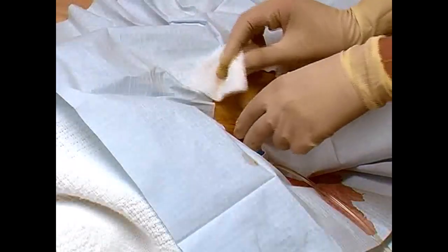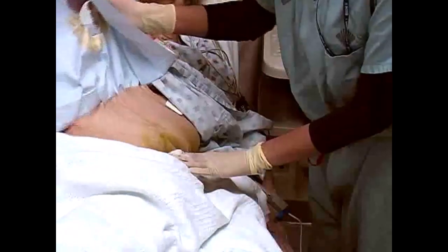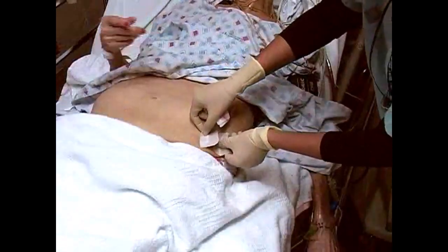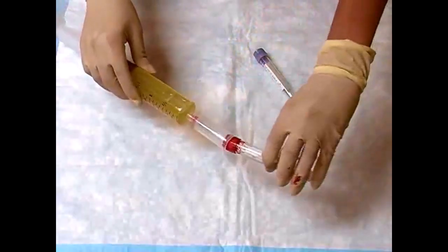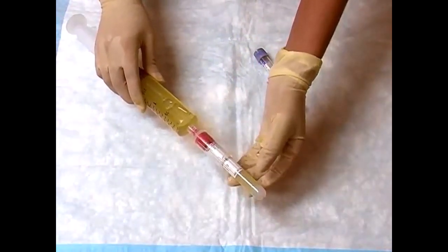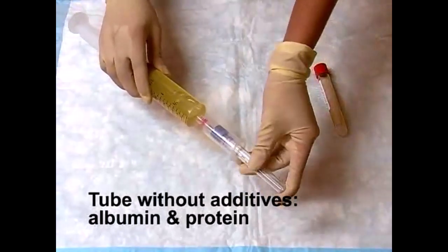Once fluid collection is complete, withdraw the catheter from the abdomen, remove the sterile drape, and wash away the cleansing agent from the skin. Finally, place a sterile occlusive dressing over the puncture site. Ascitic fluid should be promptly transferred to appropriate collection tubes and submitted to the laboratory for analysis. In general, a tube without additives is submitted for albumin and protein analysis.